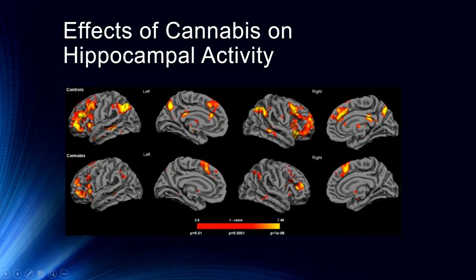But again, this is what the goal here is, just to show you what these kind of scans look like, and what we're getting into. Then, of course, there would be more analysis of these particular regions of interest and a voxel by voxel analysis, etc.